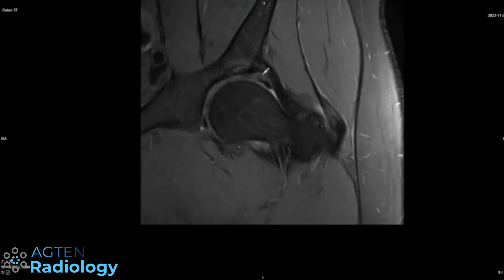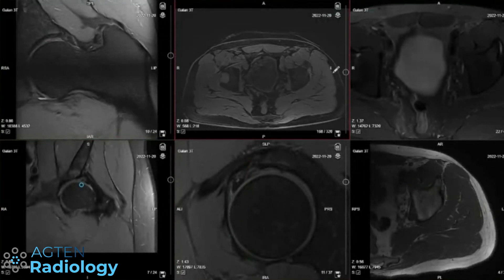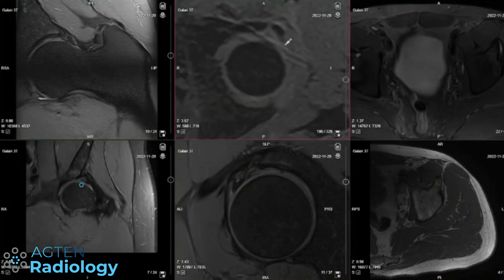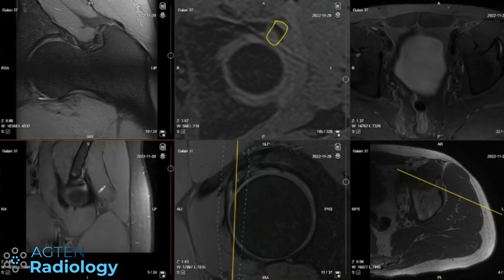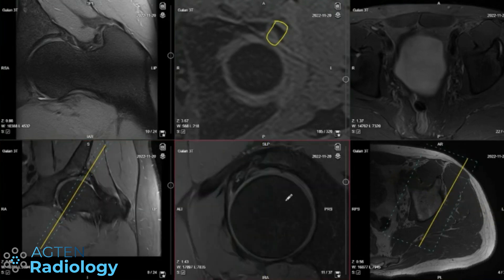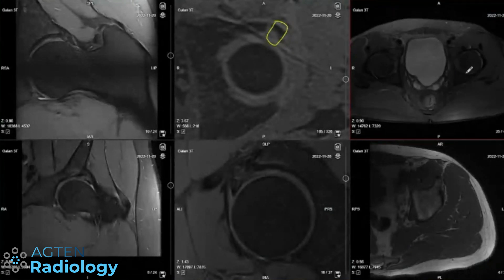And obviously the edema, and then the lateral center-edge angle factors from the x-rays, which contributes to overcoverage focally. There also seems to be a cam deformity, so basically a mixed combination of findings. She's having anterior-sided pain, yeah.